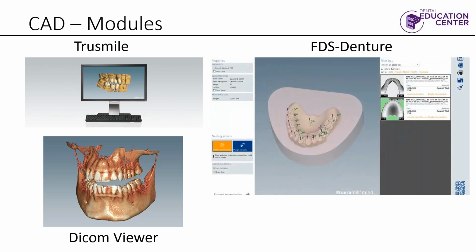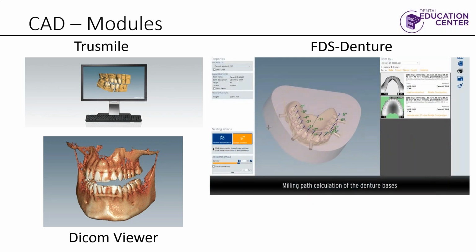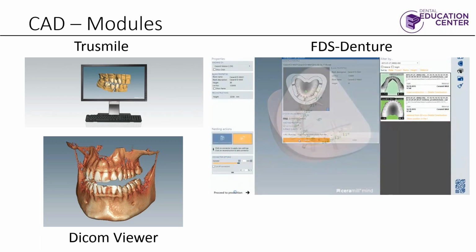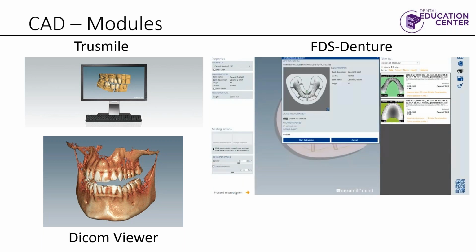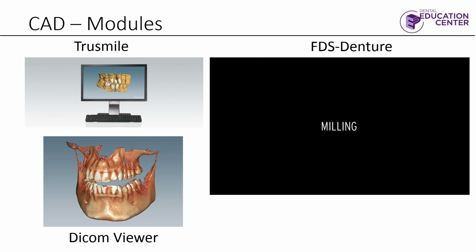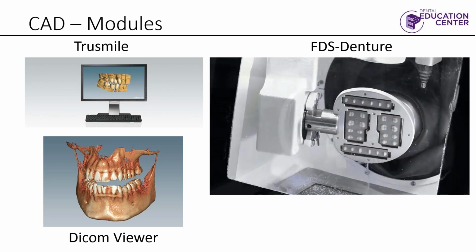It obviously doesn't mill every tooth. They're pre-made, and so it's not going to have to mill every tooth. Only the ones that need to be adjusted. Then you would actually mill the base. This is showing you how to mill it out of wax. You can mill it out of acrylic. You could print it. You could do a whole bunch of different things.